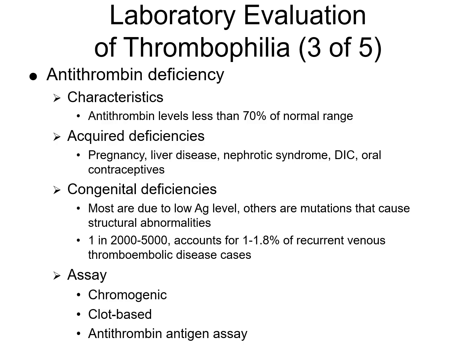We could also do a clot-based assay, which would assess the effect of antithrombin on clot formation time. And we could also do an antithrombin antigen assay, which would measure the amount of antithrombin protein present.